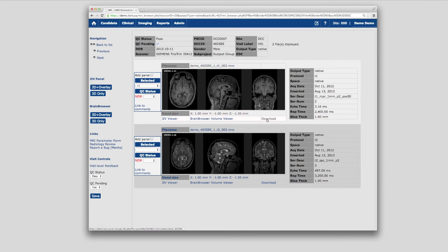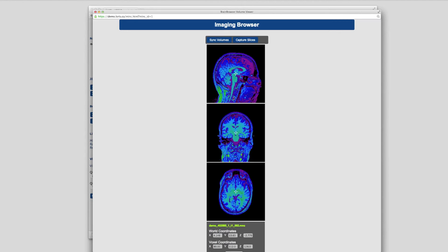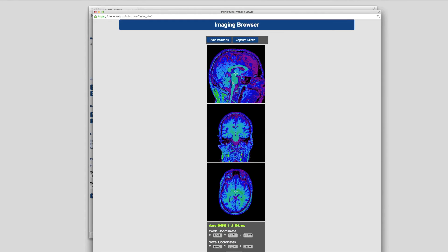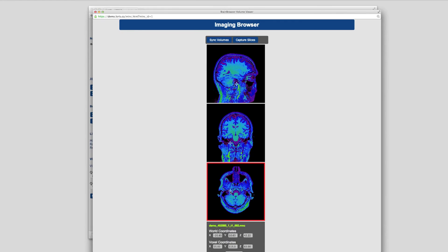Within the Scan Acquisition page, each individual scan can be downloaded directly to your desktop by clicking on the Download link. Clicking on the image will launch the visualization tool called Brain Browser. In Brain Browser's Volume Viewer window, you'll see a triplanar depiction of the volume on which you can zoom in and out, navigate around the volume in all directions, move slice by slice, capture slices, and change threshold values.